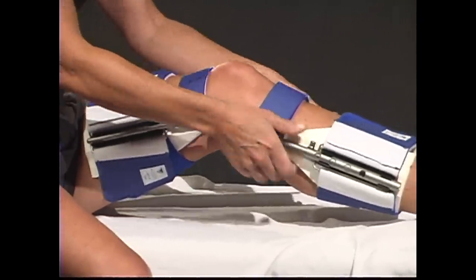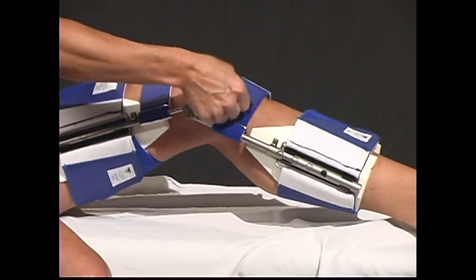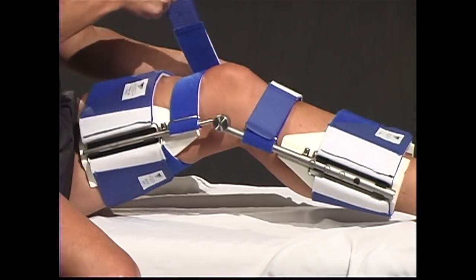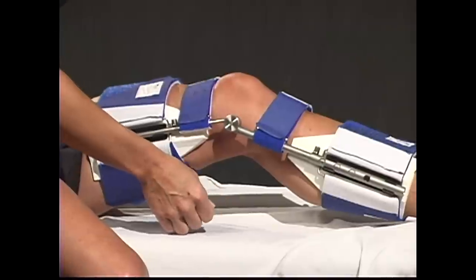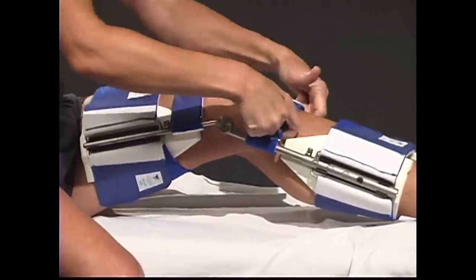To readjust and tighten the counterforce straps, pull up with both hands on the cams. Free one hand and pull one strap snug. Repeat the procedure with the other strap. Check the cuffs for tightness. You should be able to slide a finger between your leg and the DynaSplint system.